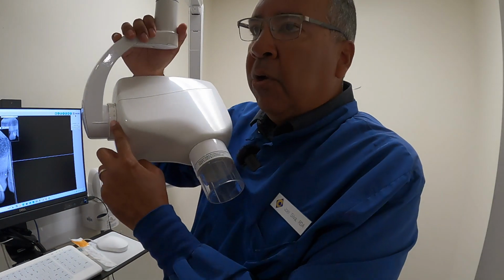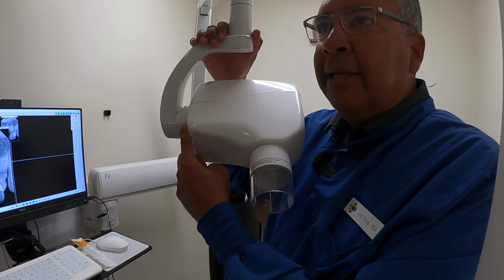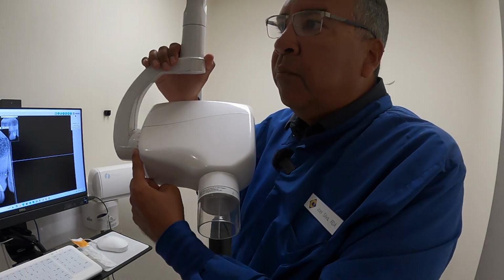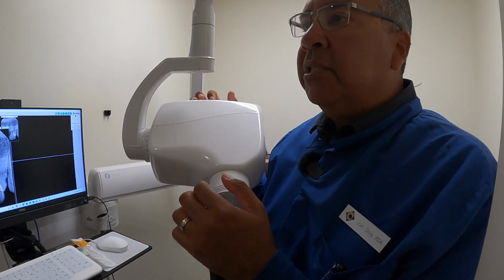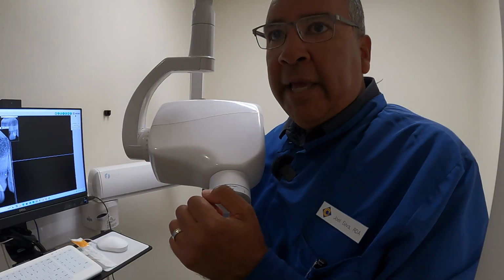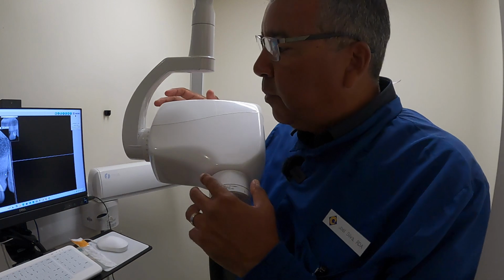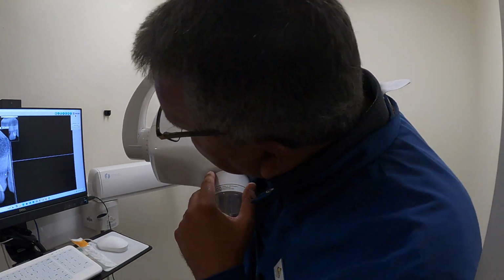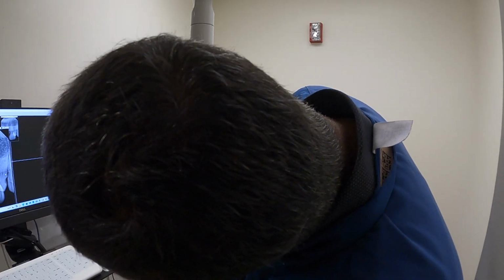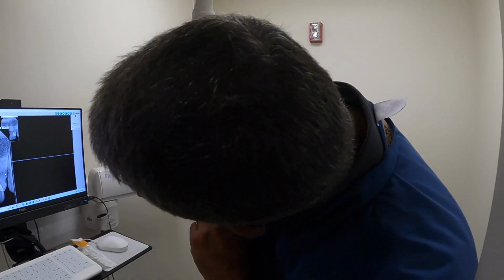The reason why I bring that all up is just to say that especially when it comes to digital radiography, whatever you're on and you found the bisector, I would typically like to add around 5 degrees more, just to be on the safe side. More positive. I'll reference this as either more positive or less positive. I won't say give it a little bit more negative, we're not even in the negative territory. We're all in the positive. It's either more positive or less positive. So we are now at 40 degrees. So I need to go to 45 because we're in 5 degree increments.